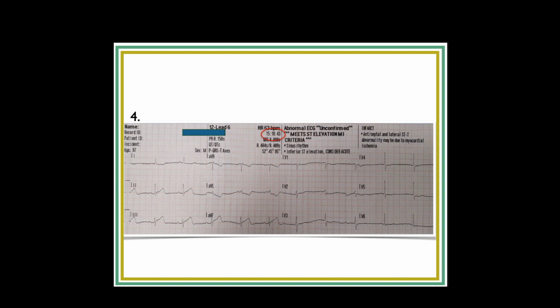But if that initial 12 lead, if you just looked at it and said, well, there's nothing bad here, and now what are we at? We're at 18 minutes. So 18 minutes after 3. If you had simply looked at it and said, nothing here, and just driven into the hospital, they would have picked it up. But how much better for you to pick it up and let them know what's happening. Okay.